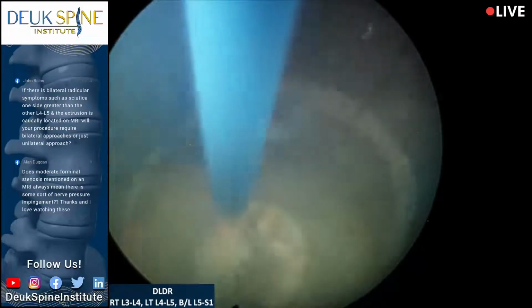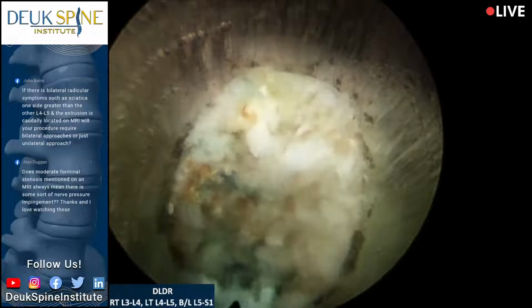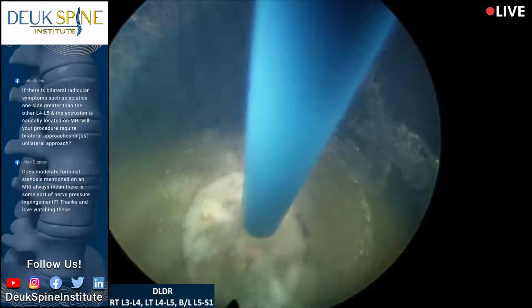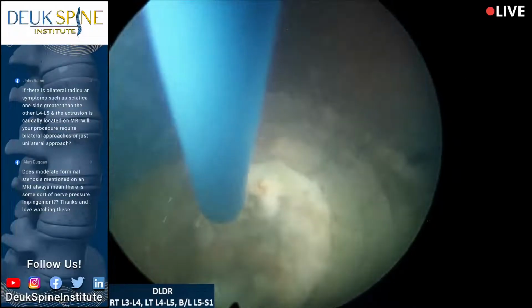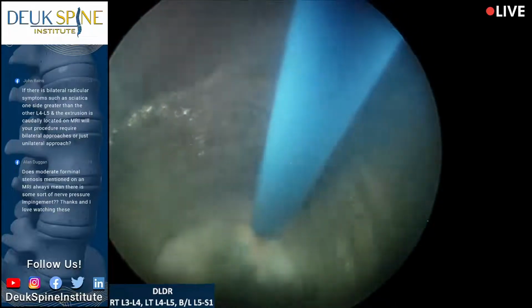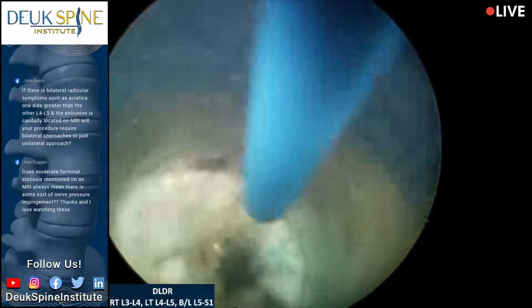Right, but the laser we use is a medical laser, and it's used in other applications in medicine as well for removing kidney stones or removing prostate cancer or other types of lesions, which I won't go into. But we use it here in the spine. So it's also used for brain surgery, to remove brain tumors, to kill brain tumors. That's a newer technology as well.